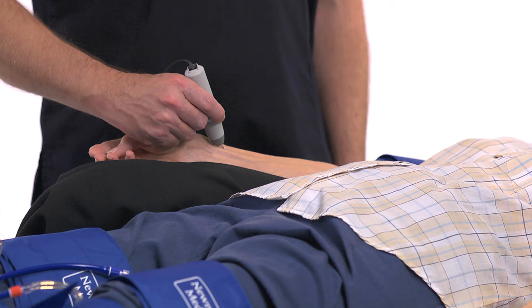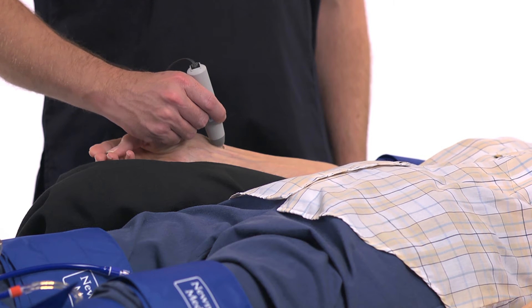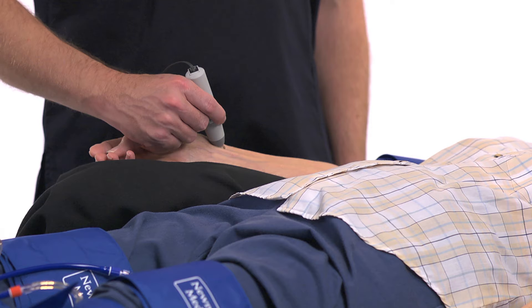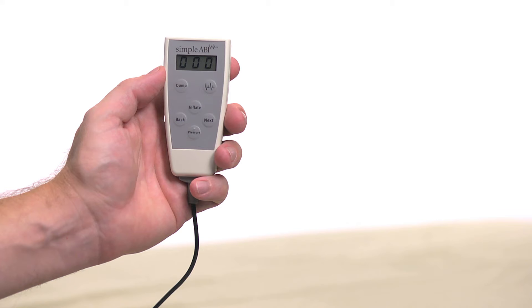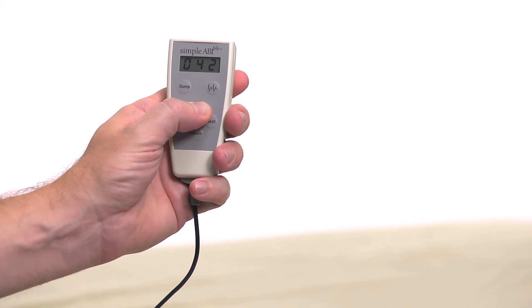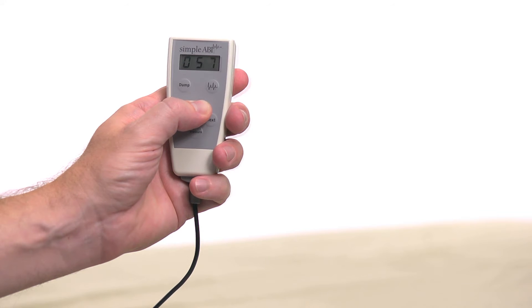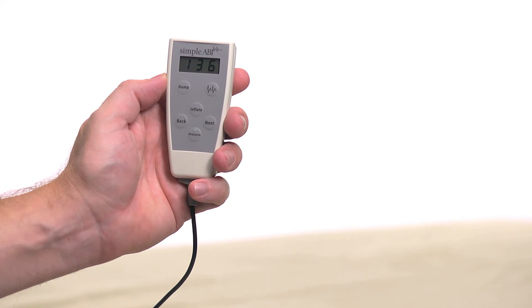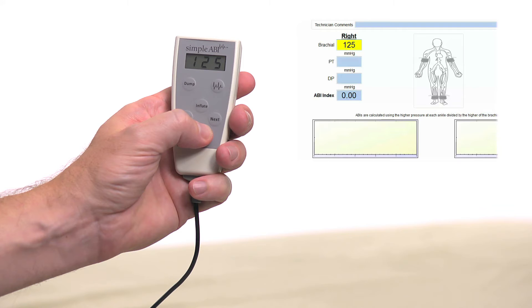Use the computer cursor and click on the right brachial field. Place the Doppler probe at a 45-degree angle to the skin over the radial artery. Move the probe slowly back and forth until the strongest arterial signal is heard. While listening to the arterial blood flow, press and hold Inflate on the CuffLink remote and inflate the cuff until you no longer hear the signal, then continue for an additional 20 mm. Release the Inflate button and the cuff will automatically start to slowly deflate. When you hear the Doppler signal return, press the Pressure button and the pressure will be entered in the right brachial field. If you want to repeat the pressure measurement, simply repeat the process and the new pressure will replace the previous one.